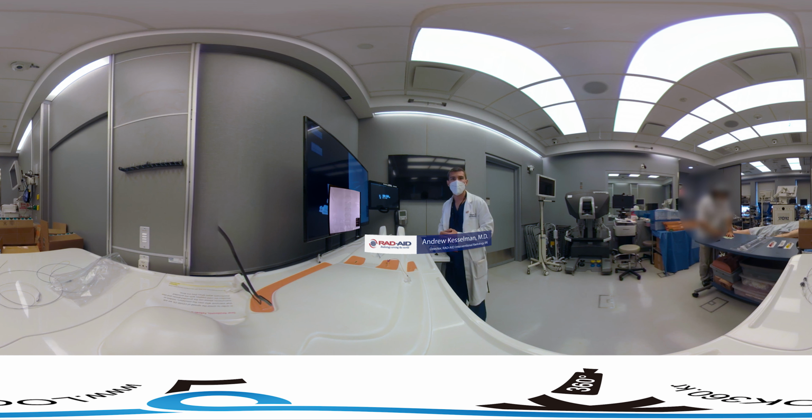Okay, so we're going to fluoro. We have the catheter up. We're going to go up with the wire. Now we're going to get above the bifurcation for the right and left internal iliac, right and left common iliac arteries. We're going to pull back down till we're over the bifurcation. I'm going to send the wire down so we go down the contralateral leg. Okay, and what we're going to do now is ride the catheter over.